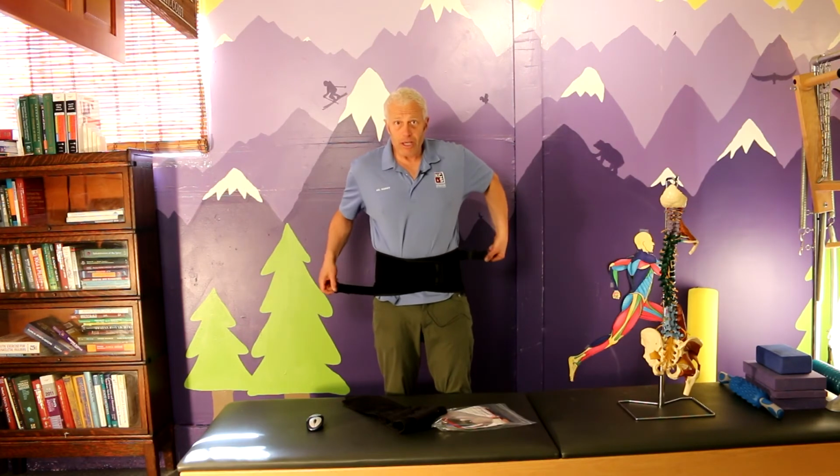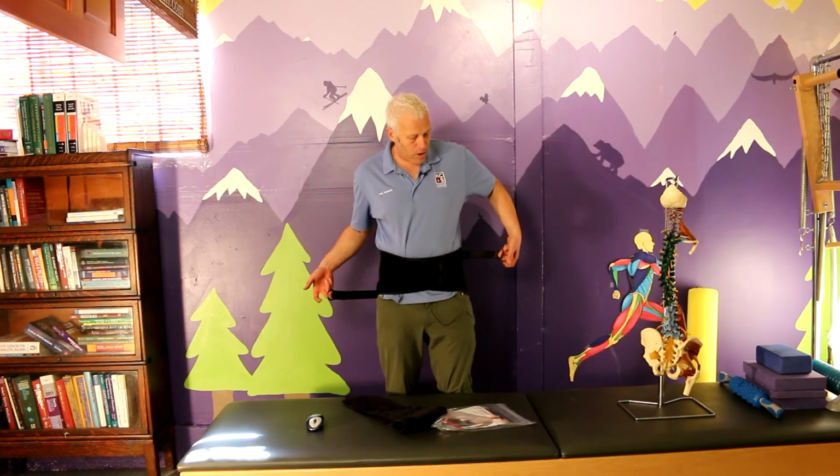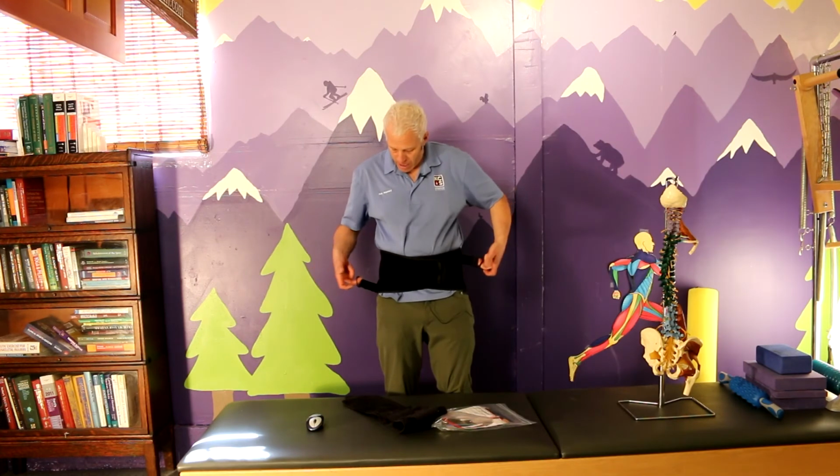And then we can use these leverage straps. The bottom one here is tightened and then the upper one here is tightened, and then I wrap around and tighten those guys. And now I have a really nice amount of support, and this is definitely a great brace.